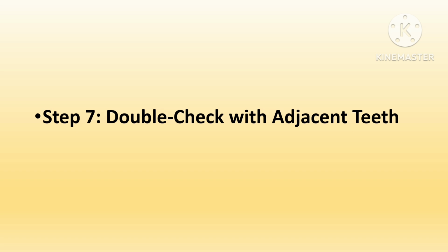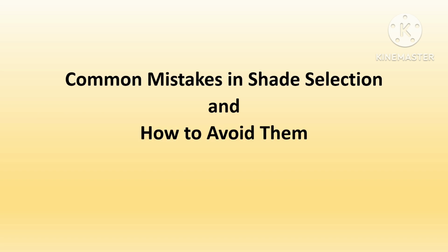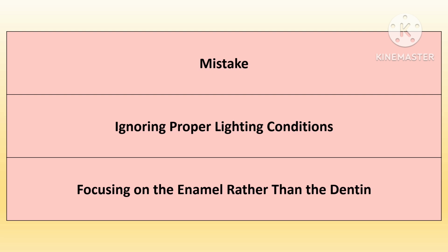Finally, always double check the selected shade by comparing it with the adjacent tooth. This is essential for achieving a restoration that looks natural and does not stand out. So let's discuss the common mistakes you can make during shade selection and the procedures or measures to avoid them.